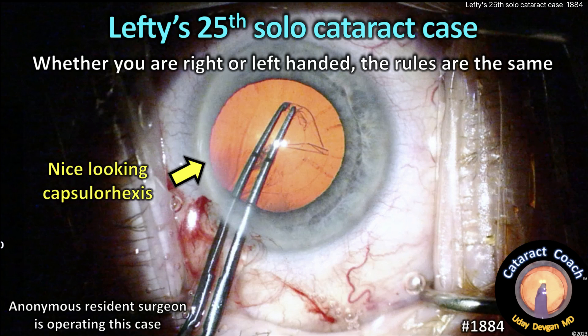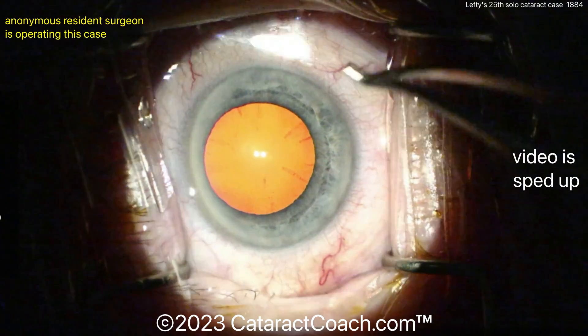CataractCoach.com. Lefty's 25th solo cataract case. Whether you're right-handed or left-handed, the rules are the same — it doesn't make a difference. So let's watch this case.